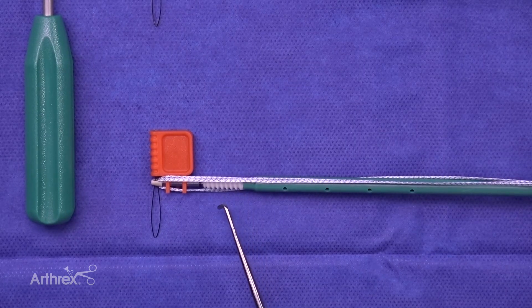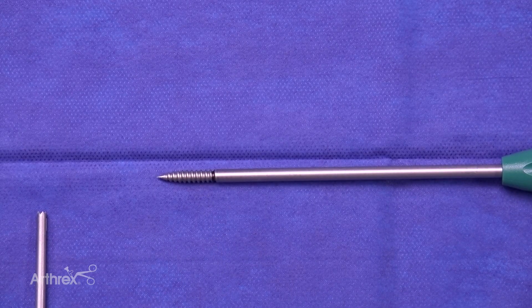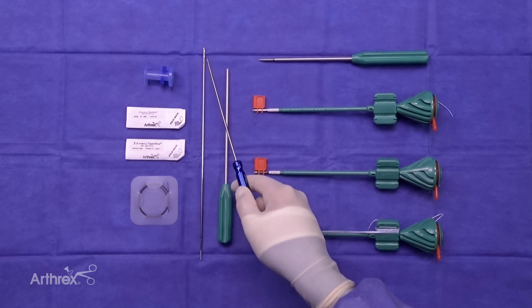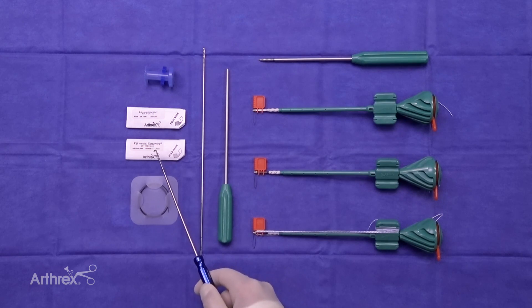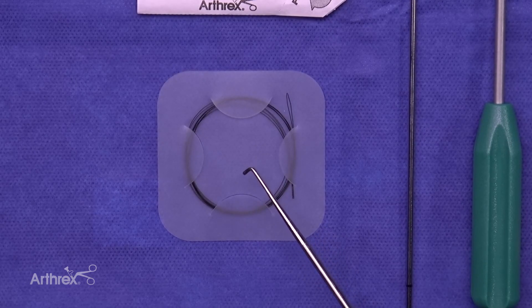One of them is preloaded with fiber tape to create the internal brace. There's a 4.75 tap to help prepare the femoral bone, and a drill sleeve to prevent the ACL from winding up on the drill bit. There's a 2.4 cannulated drill pin, a passport cannula, number two fiber wire, number two tiger wire, and finally a nitinol passing wire. We chose a 2.4 drill to minimize bone loss.